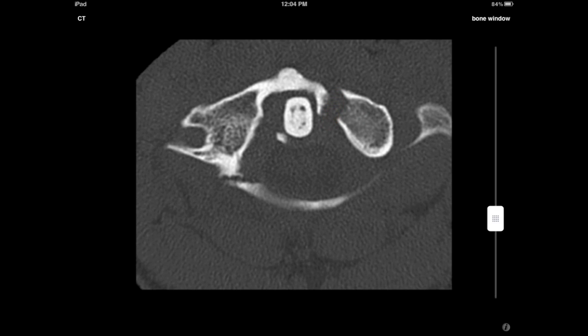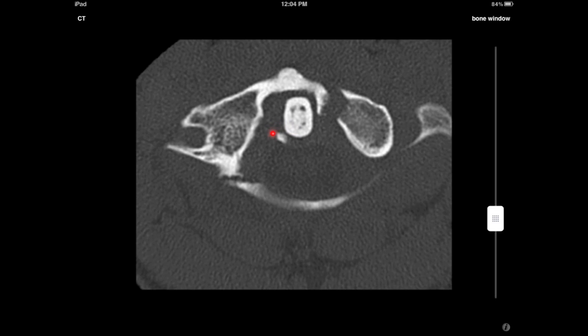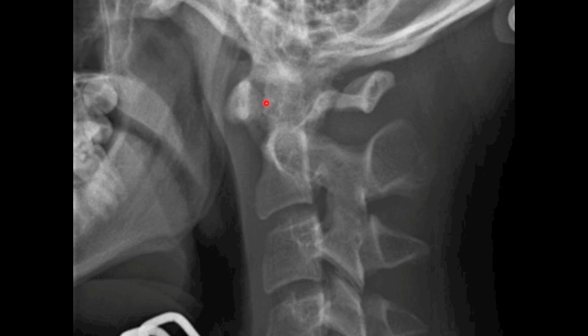Now the other important thing to note is this bone fragment here, which represents an avulsed fragment from the insertion of the transverse ligament. This is a rare but important finding in the setting of Jefferson fracture as it implies instability and explains why this patient had a widened atlantodens interval on the lateral view.